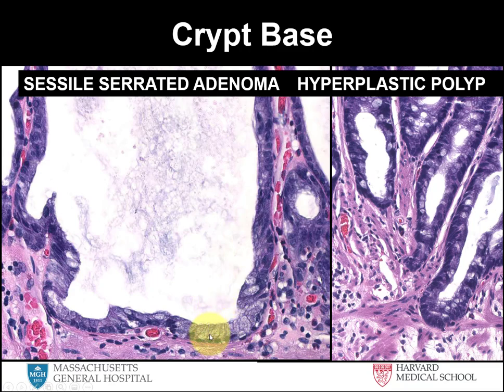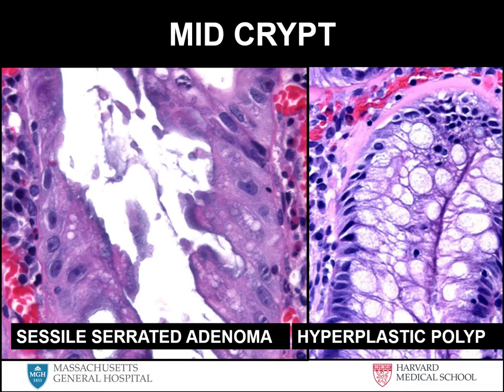It's very foveolar. By that I mean it has this fine, pale, vacuolated mucosa. If you look at the base of a hyperplastic polyp, the crypts are not only narrow, but they are composed of goblet cells and endocrine cells and perhaps Paneth cells, depending on where you are in the colon, but you do not see this foveolar mucosa. This also results in abundant mucin. So those big dilated glands in SSPs are filled with abundant mucin that extends to the surface and therefore makes these polyps hard to visualize for the endoscopist unless they use water or irrigate that area to wash that mucin off.